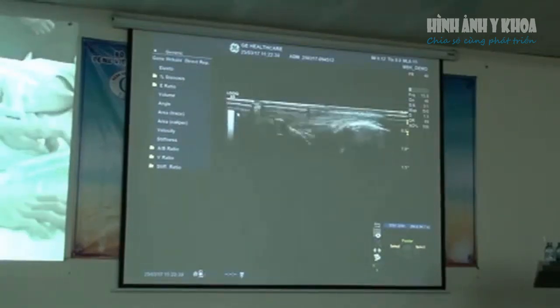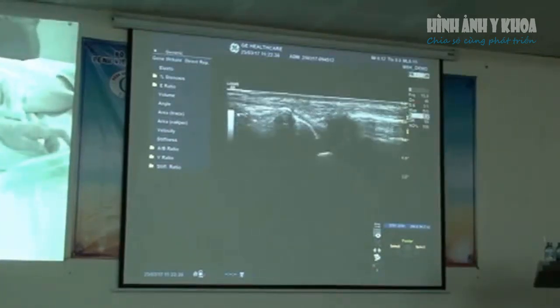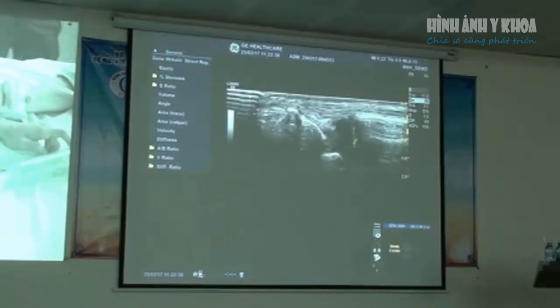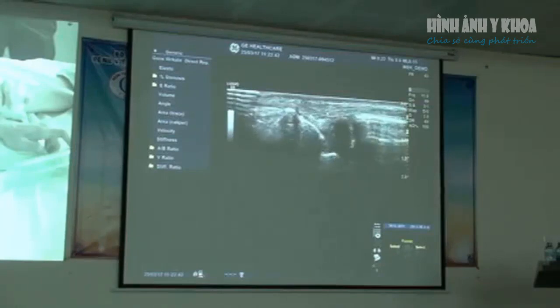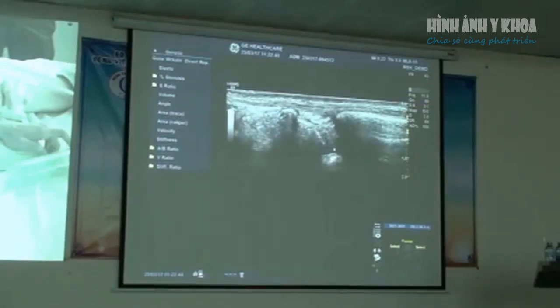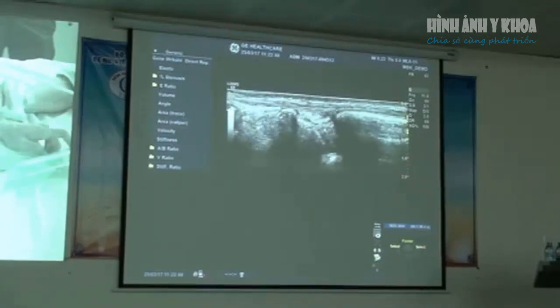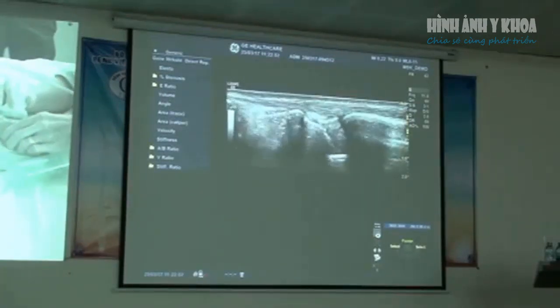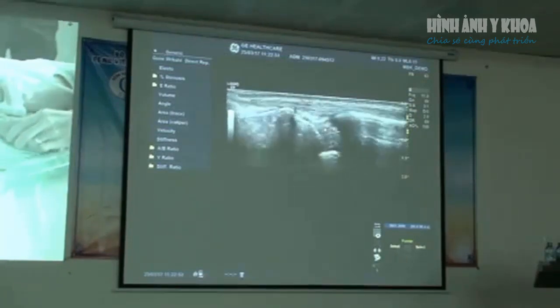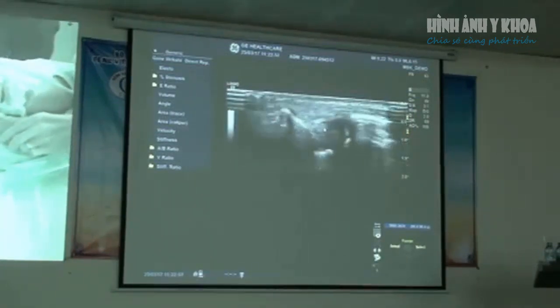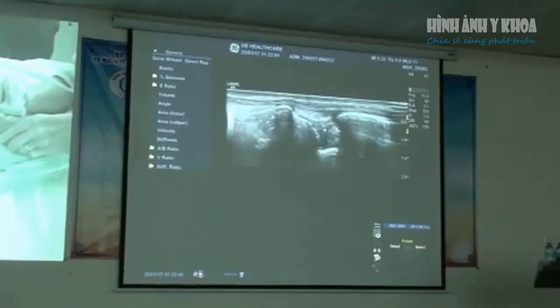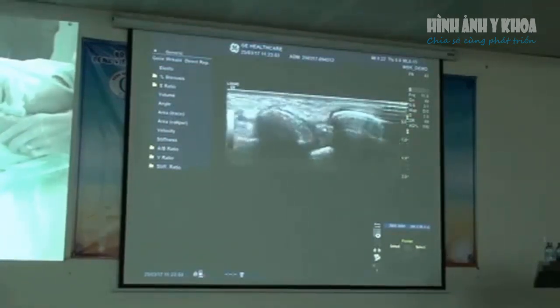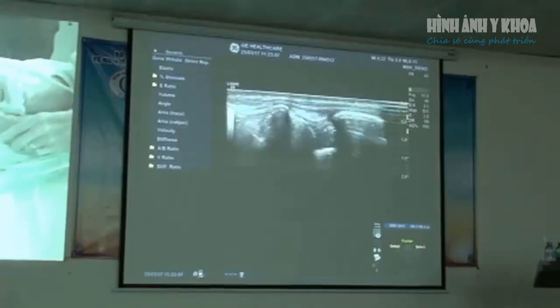To look at the Triangular Fibrocartilage Complex, just drop the frequency down a little bit. This is the extensor carpi ulnaris at the top and this is the TFCC in here. Just to check the integrity, we ulnar deviate to see if we can see any gaps or any ganglia that come out through there.